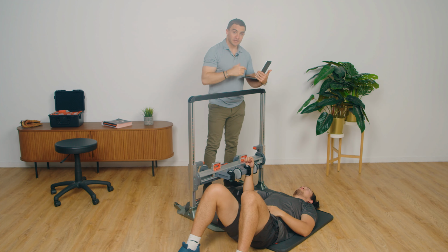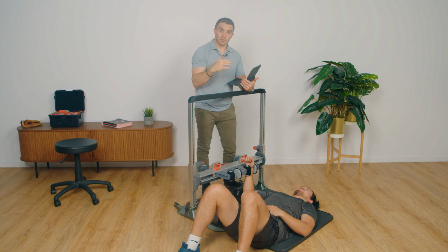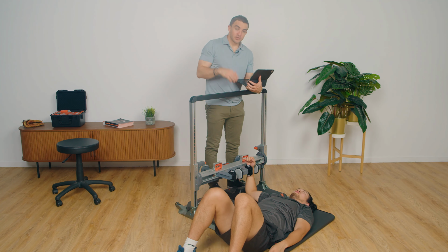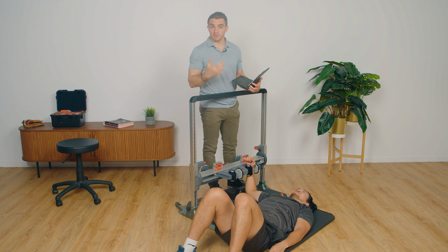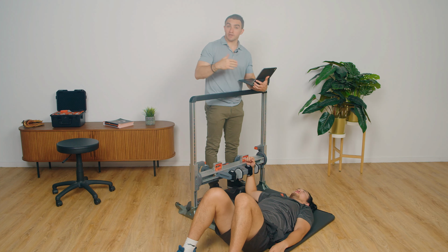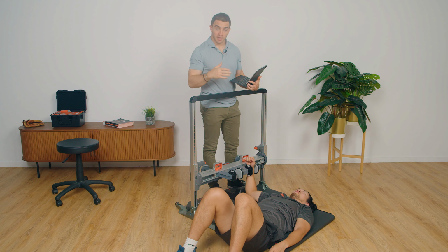But unlike the previous test where I was in control and could make sure that Cal was not moving and I could stabilize him as much as possible to really isolate that movement, there's different ways of doing that here. So when we go to perform the test, there's a couple things we have to consider. First is how are we going to provide a cue that elicits the response from the patient that we want. Early on, what I want to look at is strength. Now we can also look at things like rate of force development, but before we look at rate of force development, I'm just going to isolate strength here and my cue should correspond accordingly.